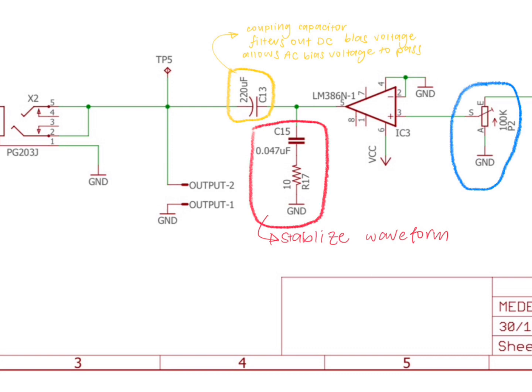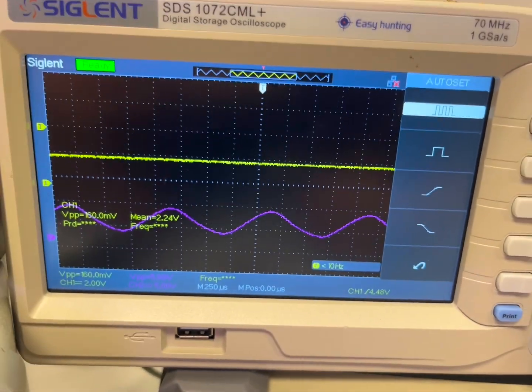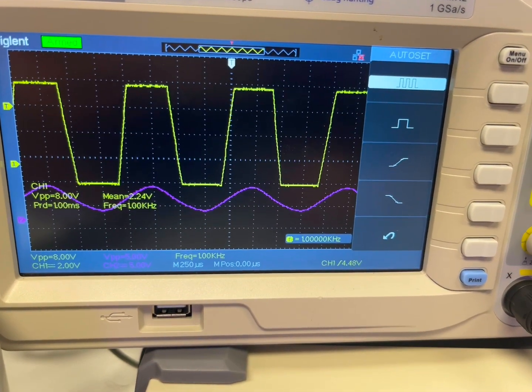The input will first go through the trimmer P2 where pin E has full amplitude while pin A and S has zero amplitude of the input waveform. To set up stage 4, we will place oscilloscope probes in both TP4 and TP5 and leave the power supply and function generator untouched. There, we can get a voltage output of 7.04 volts. By adjusting trimmer 2, we can control the output at TP5. The final output would then be the maximum sine wave without being saturated.